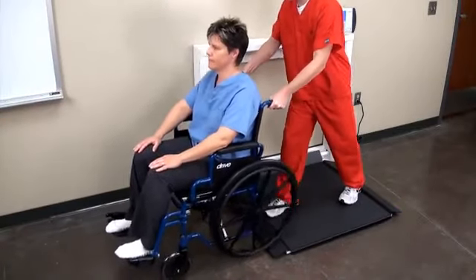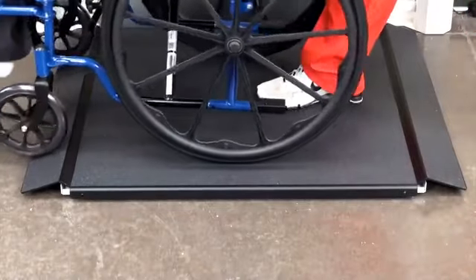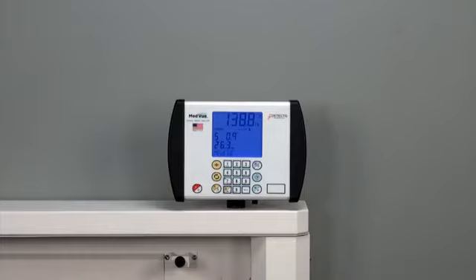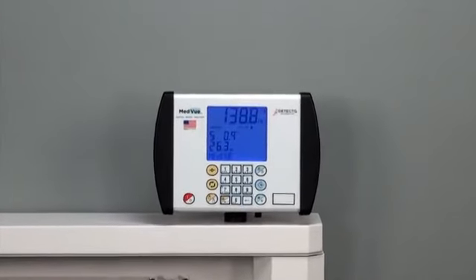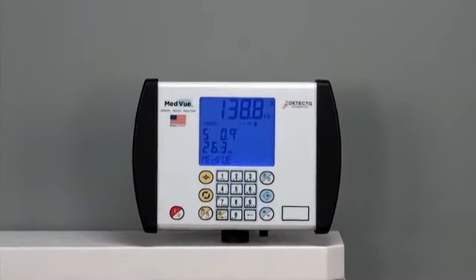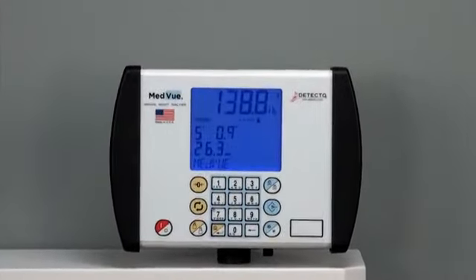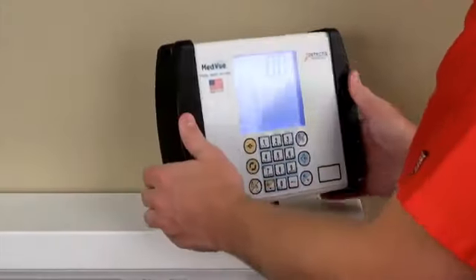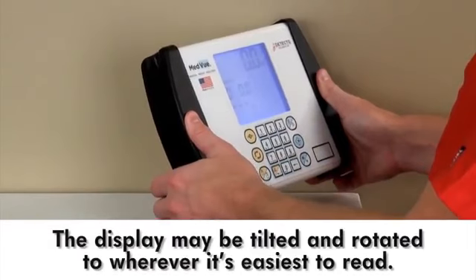The patient is simply rolled onto the scale and a platform lip holds the wheelchair securely in place. The 7550 uses Detecto's state-of-the-art, American-made MedVue Indicator, which features a 350-degree swivel mounting bracket so the display may be tilted and rotated to wherever it's easiest for the nurse or patient to read.